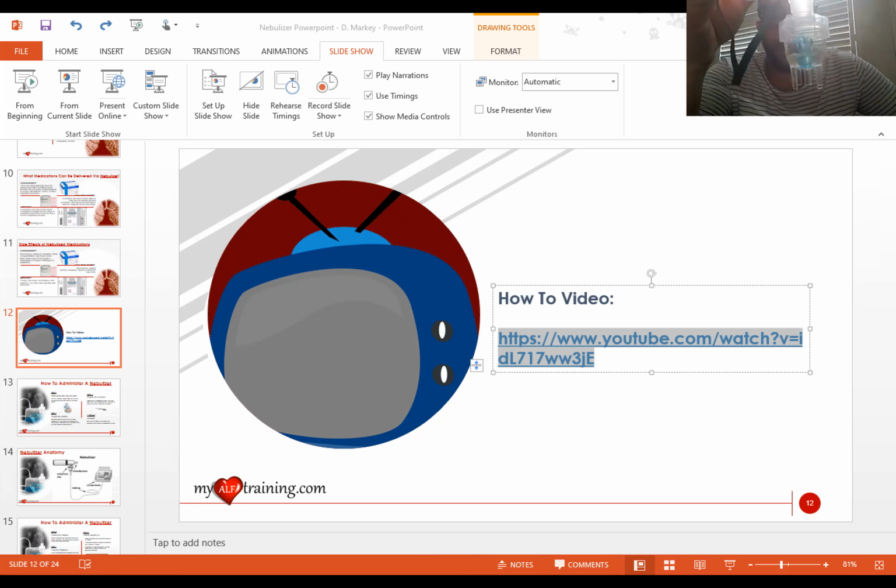And let's continue. Time, or there doesn't appear to be an appropriate volume of aerosol generated, you may want to check the nebulizer to ensure proper vertical orientation. Next, I'm going to connect the nebulizer to our gas source using oxygen tubing. It should be noted that in order to adequately power jet nebulizers, a specific gas flow is required for this device. The manufacturer in this case recommends 9 liters per minute. However, it doesn't necessarily matter what type of gas. It could be 100% O2, air, heliox, etc. You'll need to exercise good clinical judgment to determine the appropriate gas for your treatment.